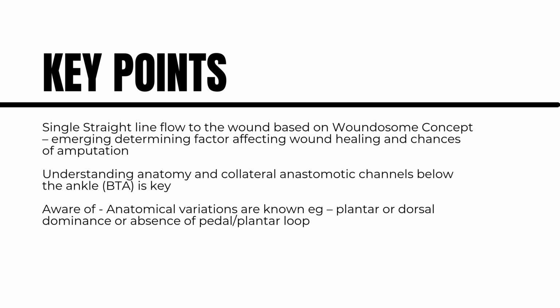So key points is that we've started doing more and more below the ankle angioplasties, and our revascularization is based on the Woundosome concept. This is an emerging factor determining overall wound healing and reducing the rates of amputation. So we would like to provide a single straight line flow to the wound based on this concept. Important to be aware about the anatomy and the existing collateral channels between the dorsal aspect of the foot, which is supplied by the DPA, and the plantar aspect, which is supplied by the PTA.